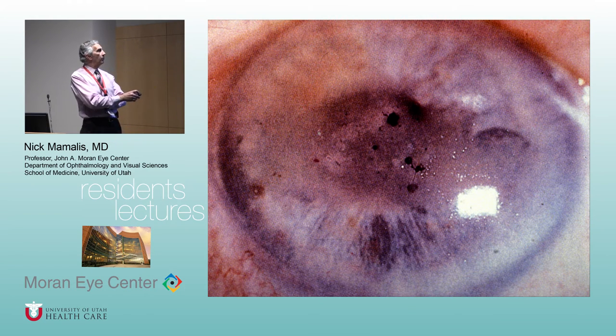Now, extra bonus points. What are these blank spaces in the middle here where the calcium is not being taken up? I'm not sure is a legitimate answer. It could be maybe a loss of a layer of cornea. Well, believe it or not, these are where the little nerves penetrate through. The nerves to the epithelium penetrate Bowman's layer, and where they do, it leaves a little circle in the calcium. If you ever had a corneal abrasion, you know that the cornea is exquisitely innervated because it really hurts. So these are just the nerves poking through the calcium.